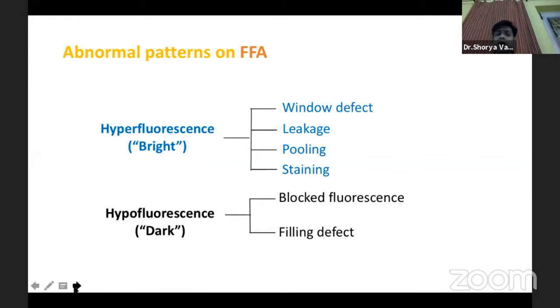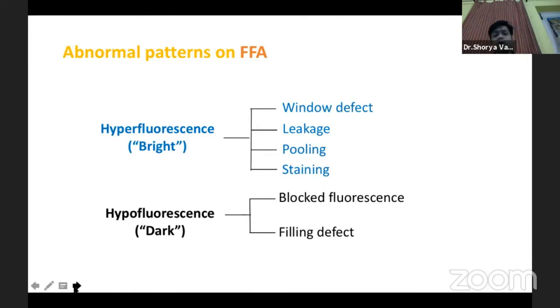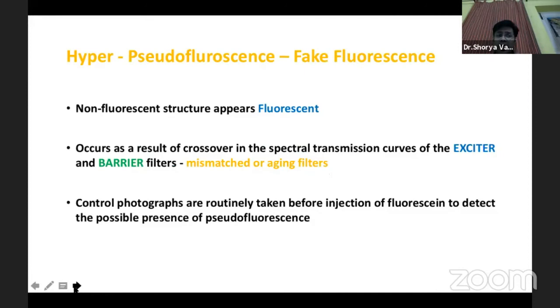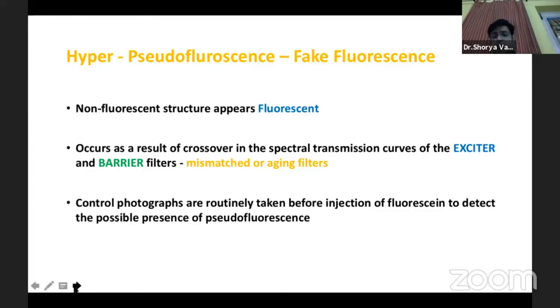Hyperfluorescence can be differentiated into four types: a window defect, leakage, pooling, or staining. Hypofluorescence can be differentiated into blocked fluorescence and filling defects. There is also pseudo-fluorescence, which happens due to non-fluorescent structures appearing fluorescent because of a mismatch and aging of the filters. That is why we take control photographs to look for any pseudo-fluorescence.